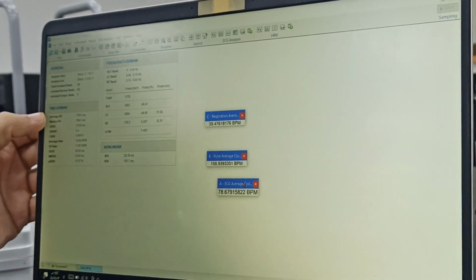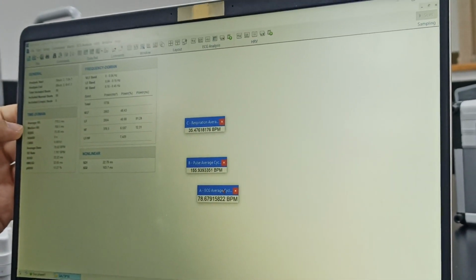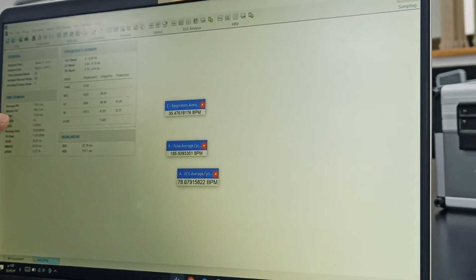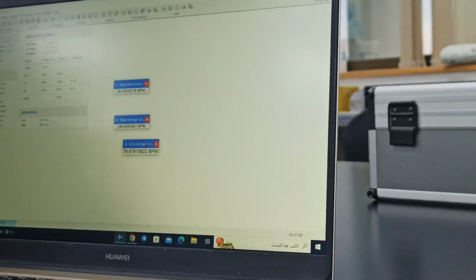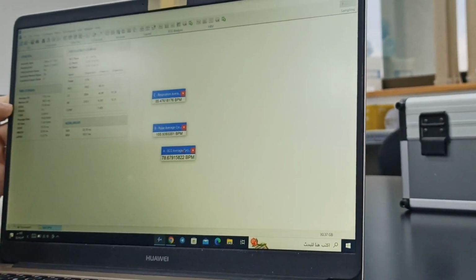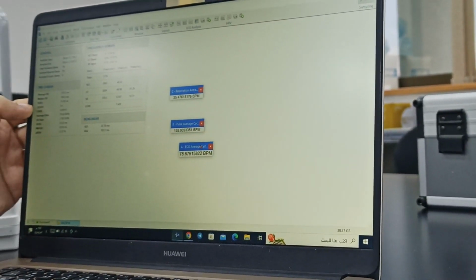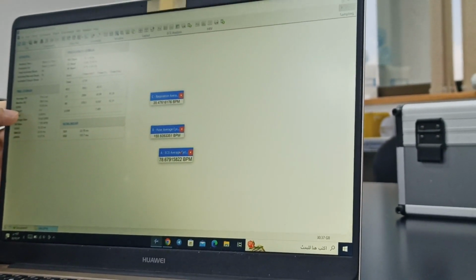Average RR: for these 98 beats, the average was 770, median 760. Then the next thing is standard deviation of RR interval, how much the beats are varying from each other. Over this whole time period, a standard deviation is calculated. You are familiar with this much statistics of standard deviation. We are not really concerned about standard deviation because these are different intervals.